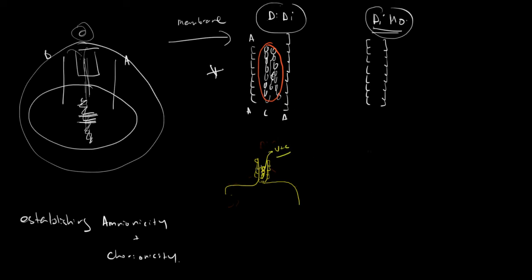And you even sometimes see some vessels running in, and then the membrane sort of tapers off, and there's usually a lot more chorion at the base, and then as you go higher up into the membrane, this is called a T section. As you go higher up into the membranes, the chorion fuses more, and it becomes a little thinner, but down here the chorion will be more prominent. Whereas, in a diamniotic monochorionic, it's a much thinner membrane, and all you have is amnion. You don't have any chorion in your T section, so there's no chorion.